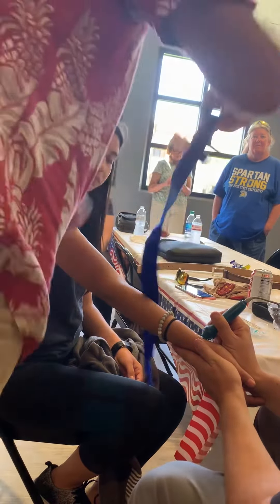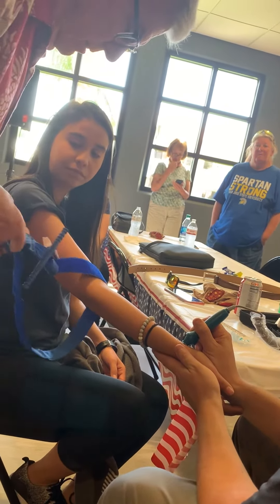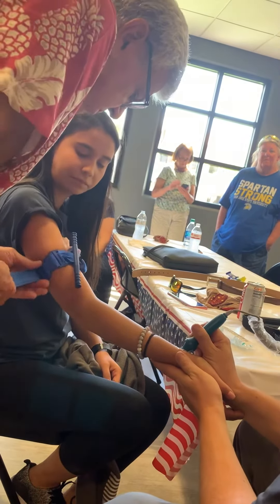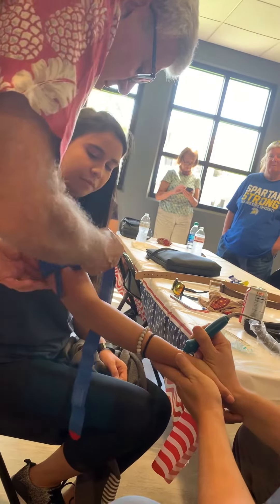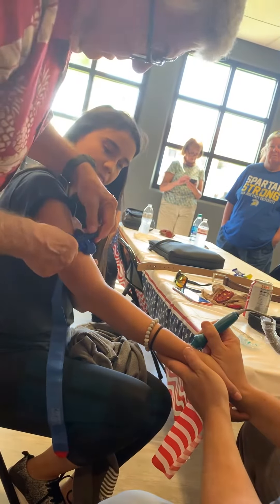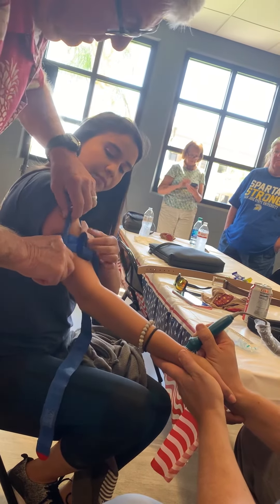Put it around. Take all the slack out, just like you're doing. We can still hear a pulse — go ahead and turn the windlass rod. Keep turning until you don't hear a pulse. You would obviously stop there. Keep turning until it goes into that C-clamp.